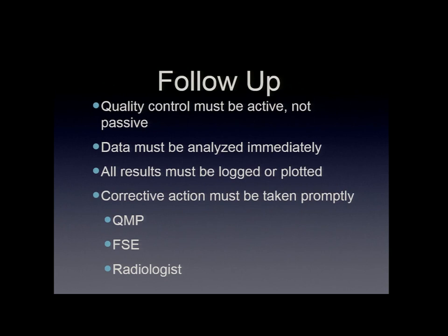The big thing is if you have a quality control program, it needs to be active, not passive. That means if there is a problem, it needs to be corrected. There needs to be documentation. There needs to be participation from the radiologists so they know what's going on in their program. If there's a problem, they need to analyze it immediately. It needs to be logged. It needs to be documented. And then, like I said, get that team together and talk to the field service engineer. We need this corrected before we can continue or not.